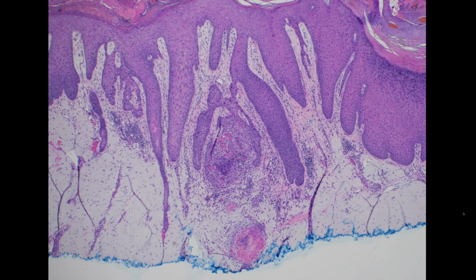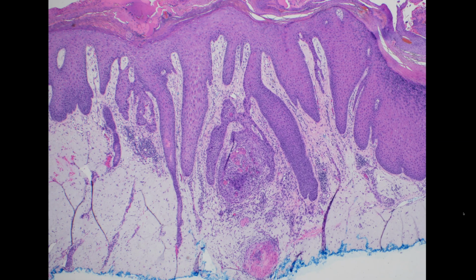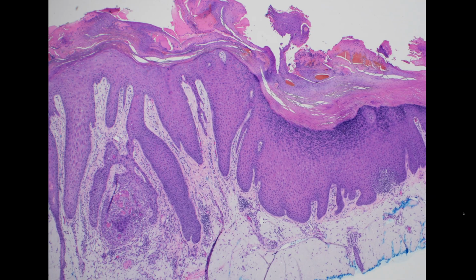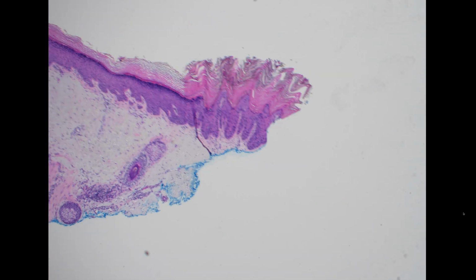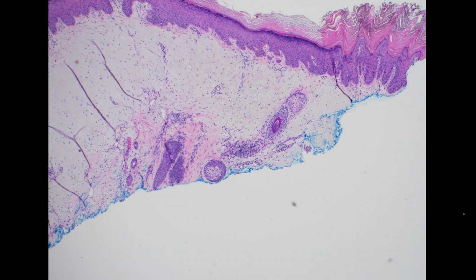So this is the main reason they did the biopsy here, was to remove this, which is an invasive squamous cell carcinoma arising out of a background of actinic keratosis. And there's also some prurigo or lichen simplex chronicus change from scratching and picking. But then at the very edge was this cute little actinic keratosis, which is just a second one. Some people have lots and lots of sun damage and lots of actinic keratoses and skin cancers on their skin.